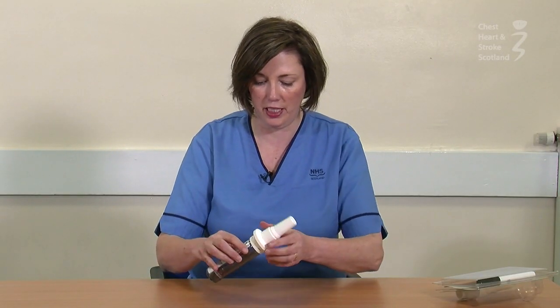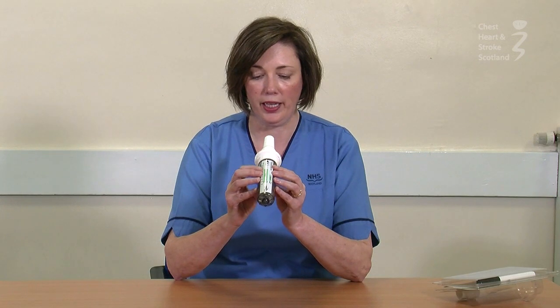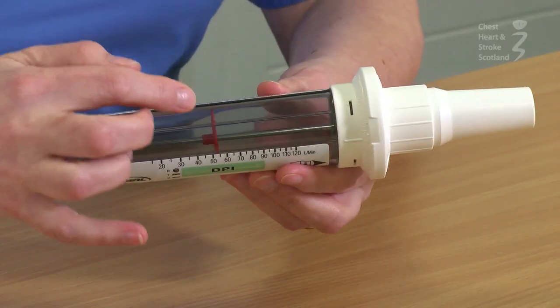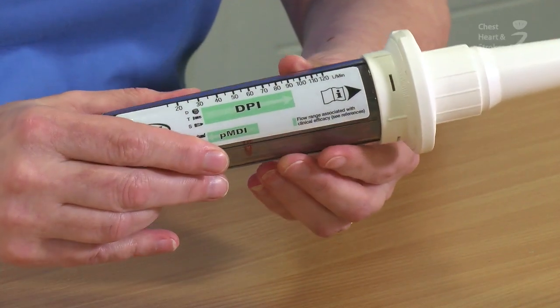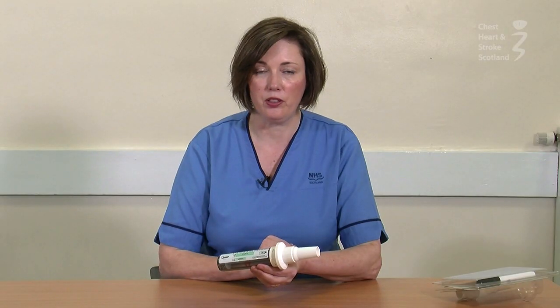Reset the device by dunting it on the table and inverting it to get the patient to do it again. This time, we can see that the red wheel is in the green zone and it would be suitable for the patient to use that device.